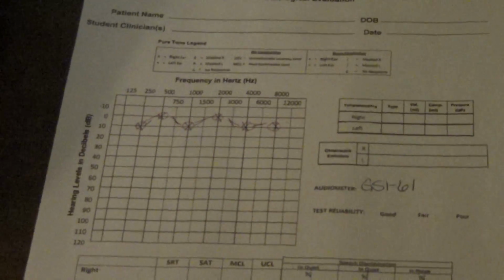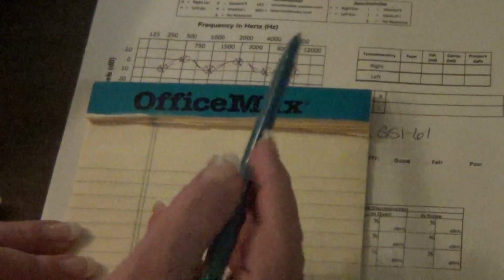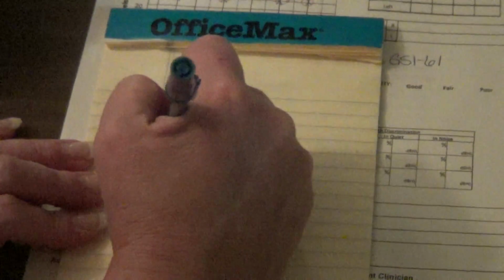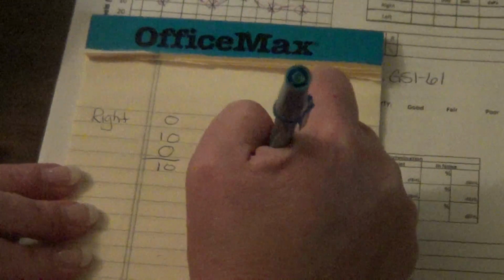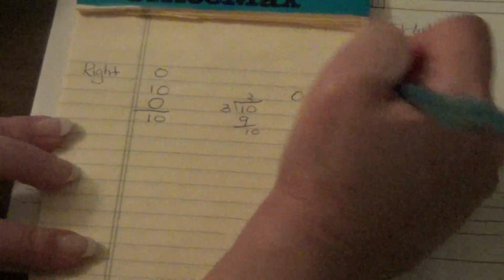So after you've done your air conduction testing and are getting ready to do your SRT, you'll want to figure out your pure tone average for each ear. If you remember, that is the average of 500, 1000, and 2000 hertz. So if we look at the right ear, at 500 hertz we have 0, at 1000 hertz we have 10, 2000 hertz we have 0. So basically we have 10 divided by 3, which is 3.333. So we know that our SRT should probably come in anywhere between 0 and 5 decibels.